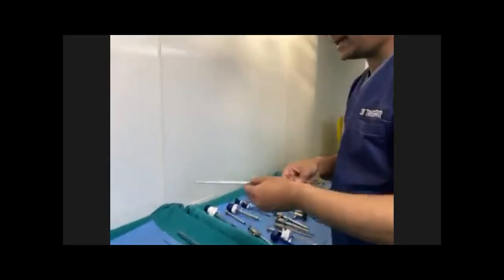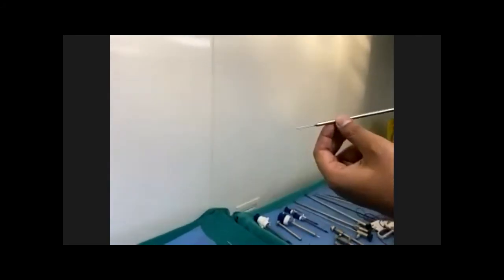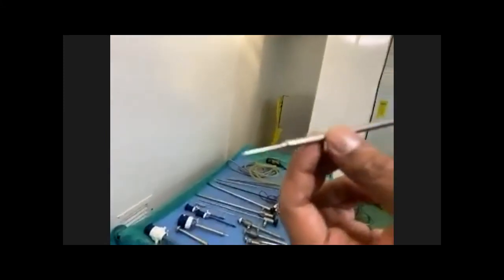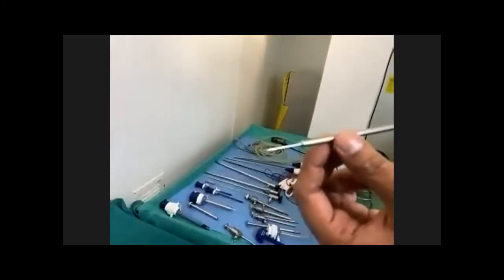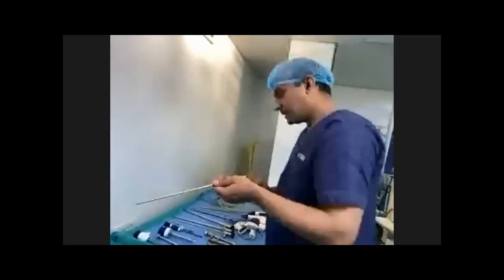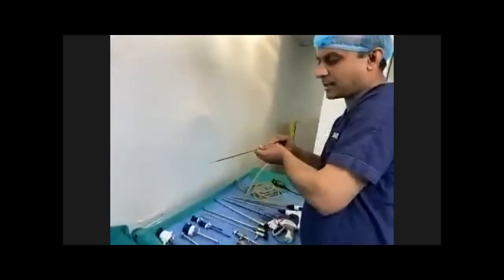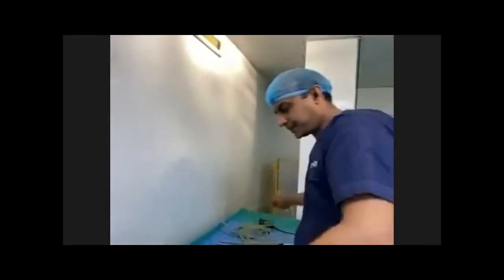Here you can see another instrument, which is an aspiration needle. When you have a very tense gallbladder like empyema, or it has thick walls and is fully filled, or the stone is impacted at the neck of the gallbladder, you usually put this aspiration needle in with much safety, and then you attach it to the suction and you suck out the bile or the pus inside the empyema gallbladder.